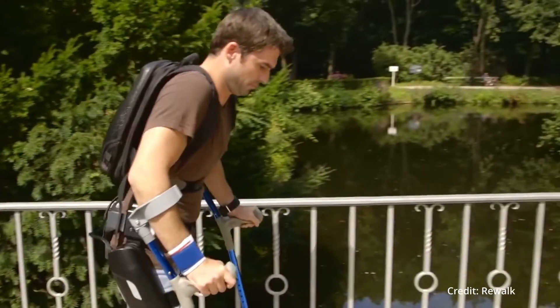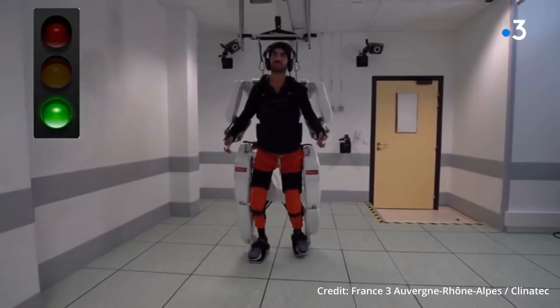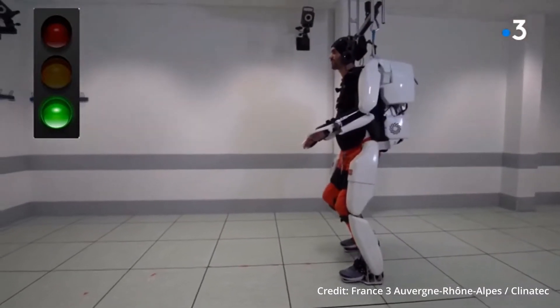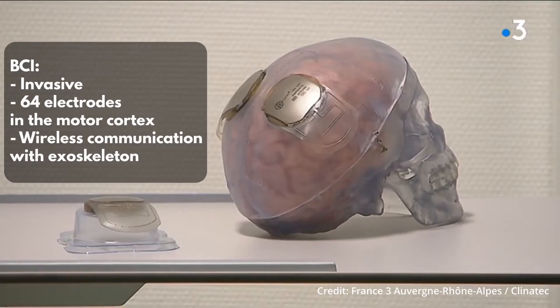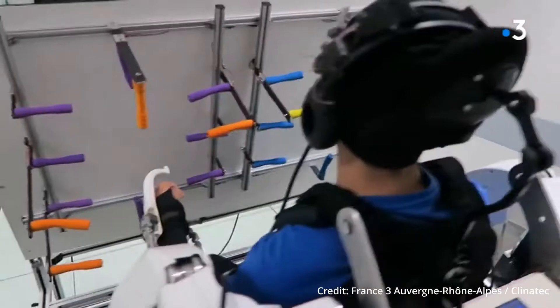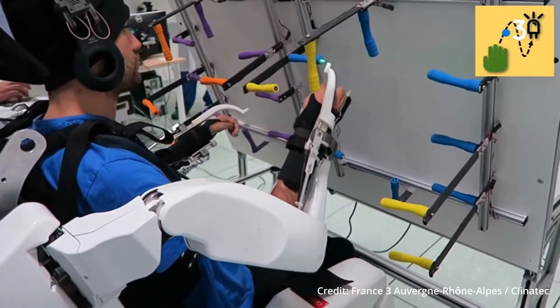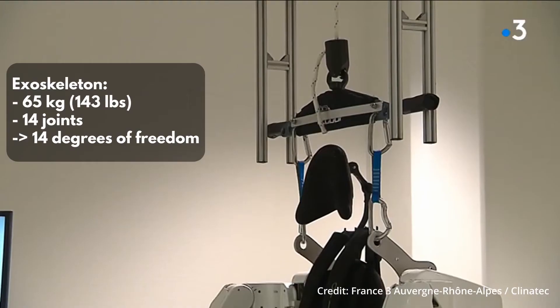Exoskeletons are already in commerce for paraplegics, for example the ReWalk exoskeleton we're seeing in this video. But of course the next step would be to use this technology also for quadriplegics. A famous case was highlighted in a 2019 study by the University of Grenoble and the Research Center Clinatec. This two-year study achieved something never done before: developing an exoskeleton controlling all four limbs with a brain-computer interface — an invasive one, directly implanted in the motor cortex of the patient with 64 electrodes — capturing signals from the brain and transducing the patient's thoughts about movement into control for the motors.